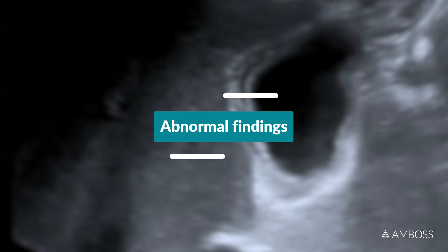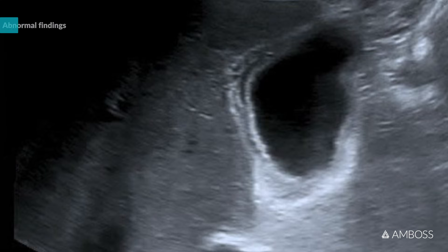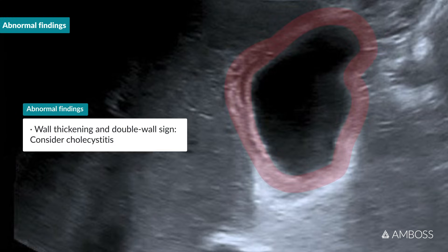Abnormal findings. An abnormally thickened gallbladder wall may suggest acute cholecystitis. As you can see here, this may also result in a layered appearance, with a hypoechoic layer of edema between two hyperechoic wall layers. This is called the double wall sign.